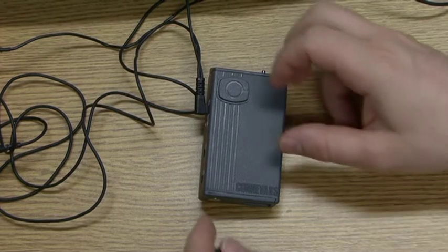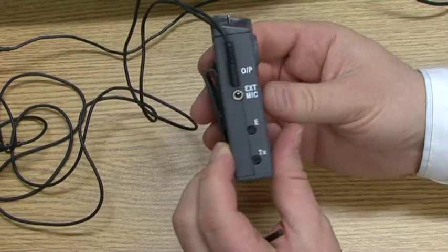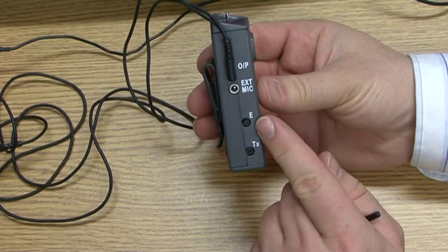If we look at the side, the environmental microphone adjustment is marked as E. The transmitter microphone adjustment, also known as the gain control, is marked as TX.